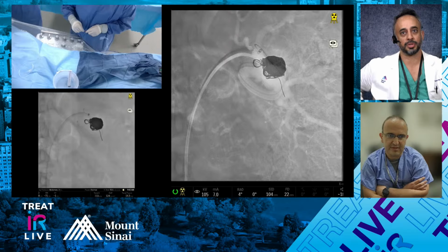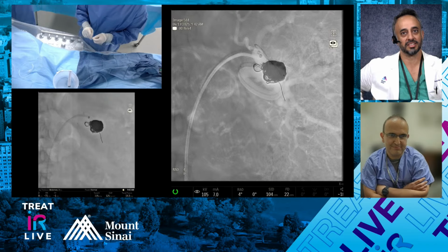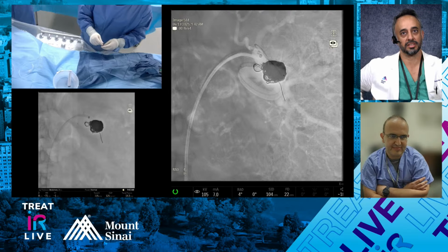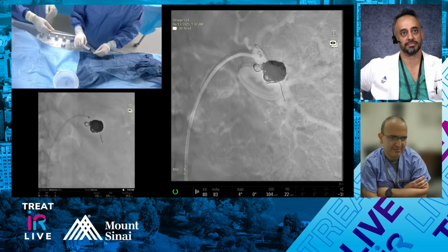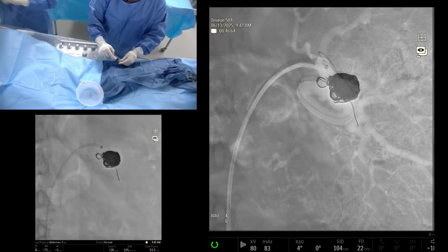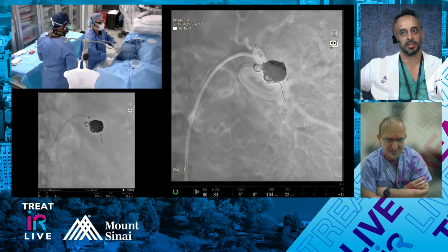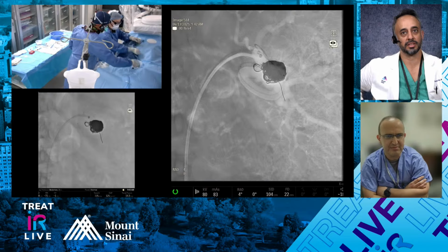It looks like that packing coil just sort of leaked into your aneurysm and it's filling up your aneurysm. It's just filling up quite nicely, creating a nice dense pack. So what we're gonna do is we'll do an angio after this. We're gonna set up to do an angio after this. Yeah, and I mean, maybe I'm just imagining this, but it seems like the coil pack is increasing in density, which is a good sign when it starts clotting, right? Yeah. Agree. Yeah, absolutely.